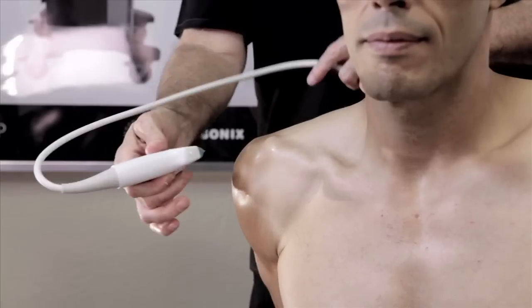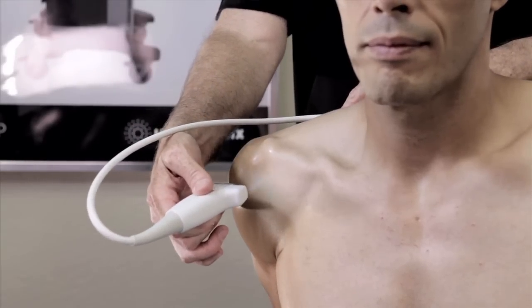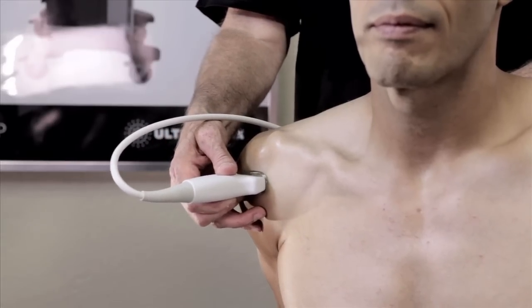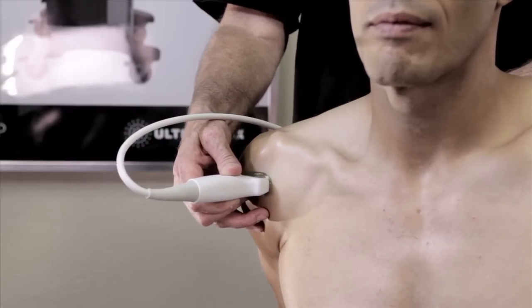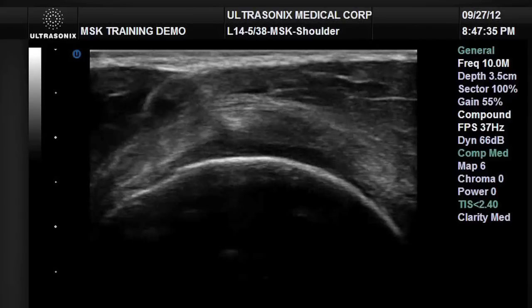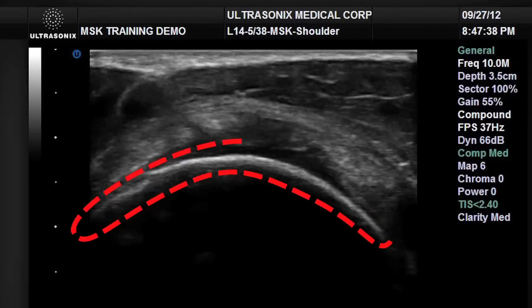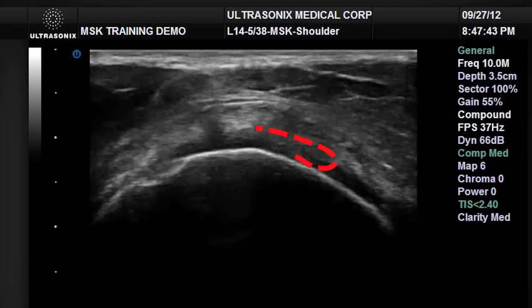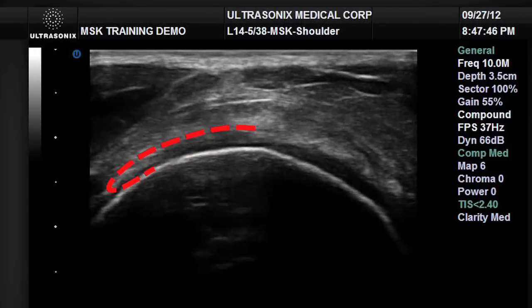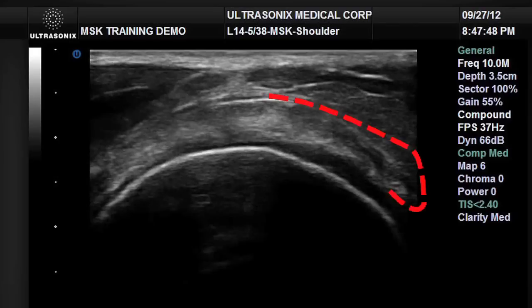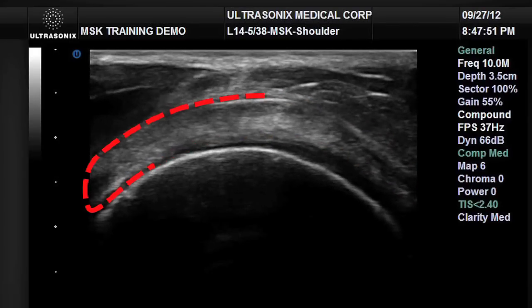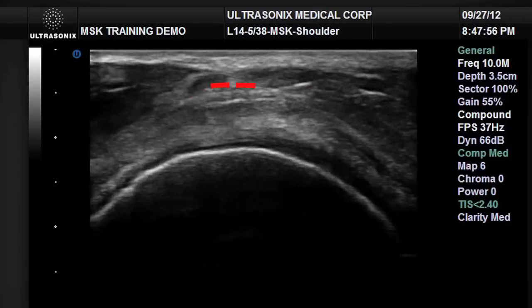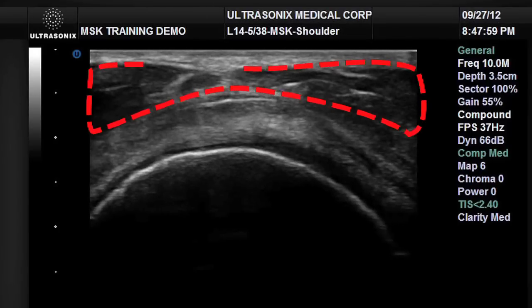We're going to get our short axis image first, placing the probe parallel with the floor in short axis orientation relative to the patient's body in neutral anatomic posture. With a firm probe placement identifying the broad round convexity of the humeral head, and by toggling the probe, we identify the cortical margin of the humerus, the black anechoic layer of hyaline cartilage, the supraspinatus tendon wrapping around the humeral convexity, the potential space for the subacromial subdeltoid bursa, and the deltoid muscle superficial to that.